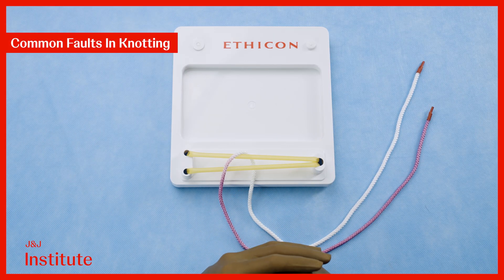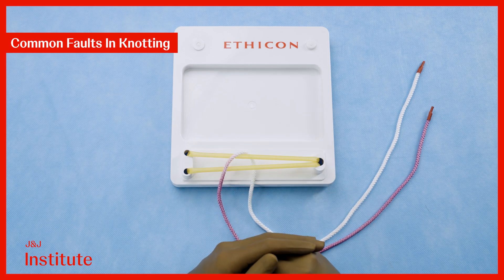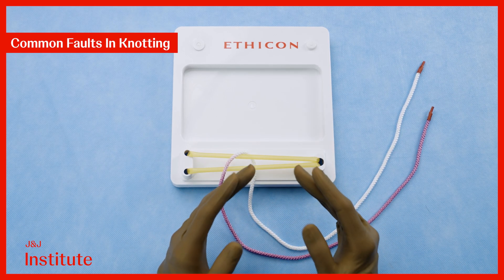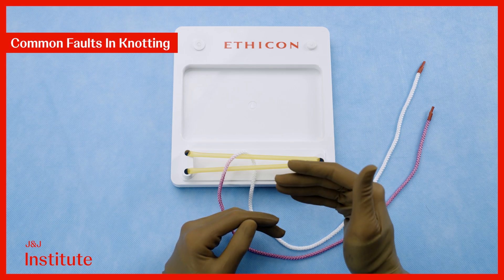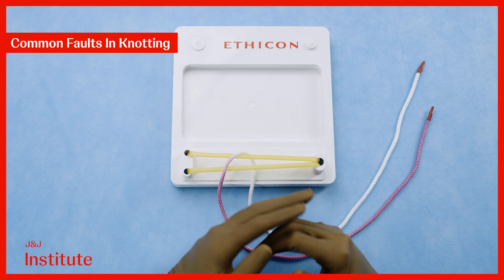I will now demonstrate some common mistakes with single-handed knotting and how they can jeopardize knot security. To recap, a secure reef knot requires alternating coming down and going up throws, crossing the hands with each throw.